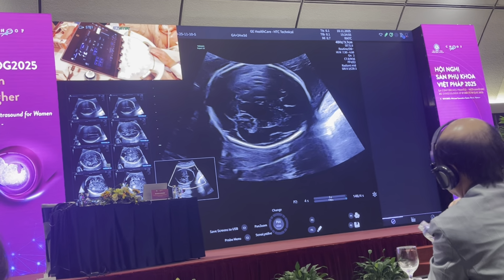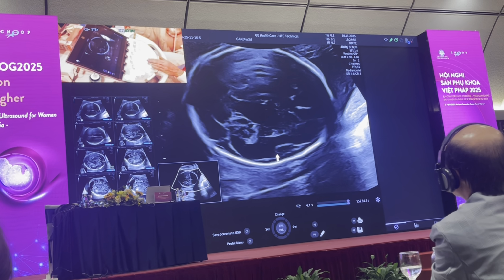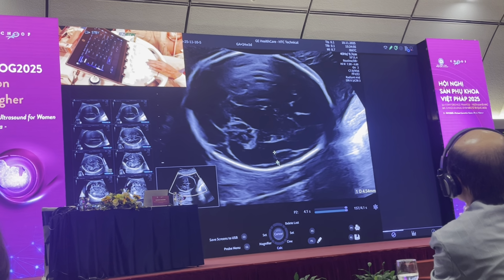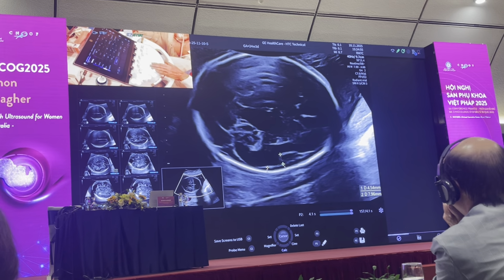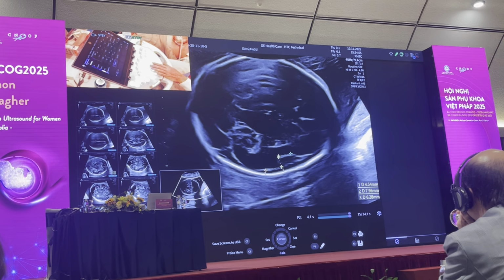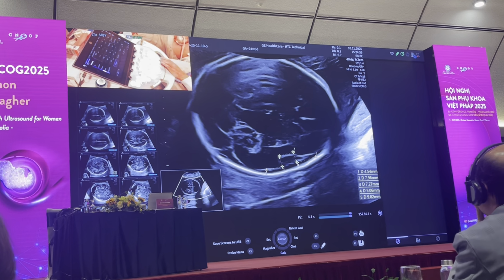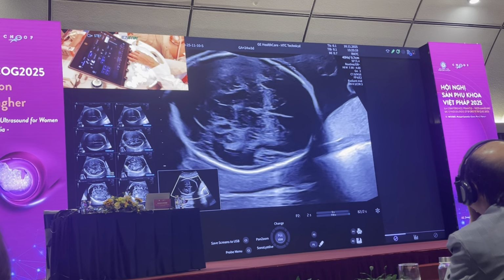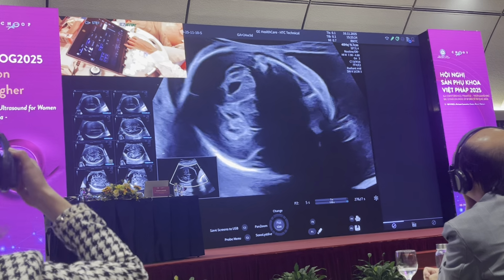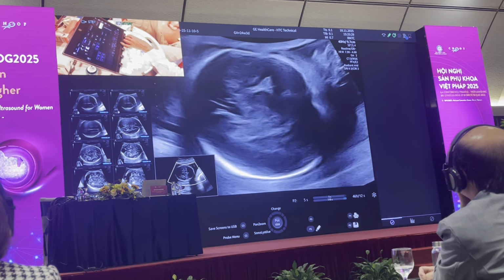So if you look at that Sylvian image there, you say, Simon, that looks okay, because it's coming up at 90 degrees in that Sylvian fissure. Because at 24 weeks of gestation, that's exactly right. But I can't see it coming down the opposite side. This is the shape of the Sylvian fissure that you would expect at 24 weeks of gestation. But it's pretty close to it. And with regard to the cisterna magna, you want to look at the cisterna magna and see if there is any evidence of an arachnoid cyst.